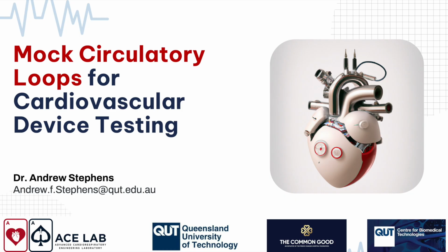We also use in vitro testing, which is basically anything that occurs on the benchtop. And this is another place where you can iterate quite cheaply. Once we're pretty close to what we want, we move to in vivo, which is animal trials, and then, of course, clinical trials. And believe it or not, all of these steps can be used as evidence in the regulatory approval pathway. So it's not just about your clinical trials.